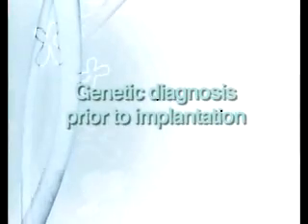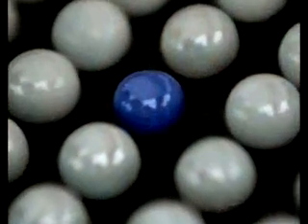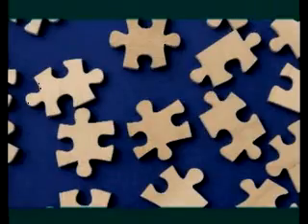Pre-implantation genetic diagnosis. Conventional assisted reproduction techniques select the embryos to be transferred based on morphological criteria, that is, observing their form and external aspect. However, the chromosomic count cannot be detected under the microscope, as embryos of an apparently good aspect may present anomalies and, as such, lack pregnancy potential.